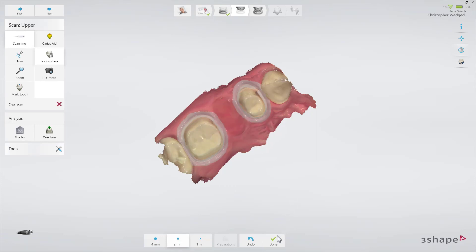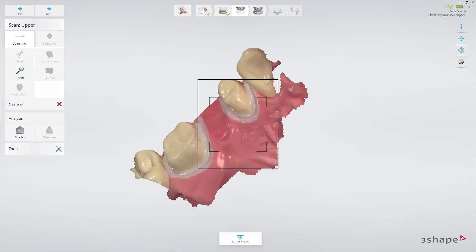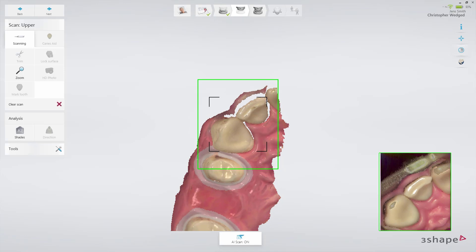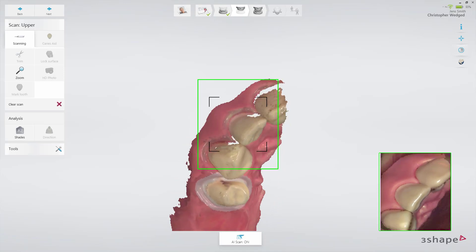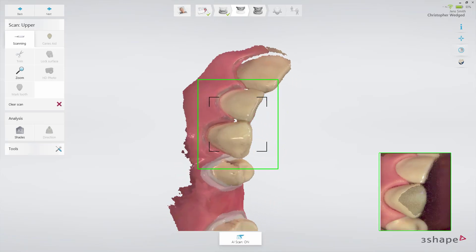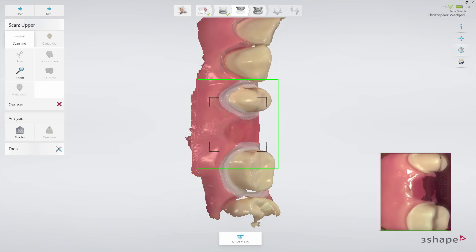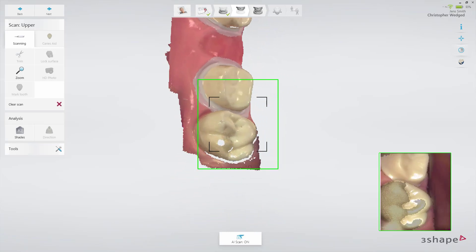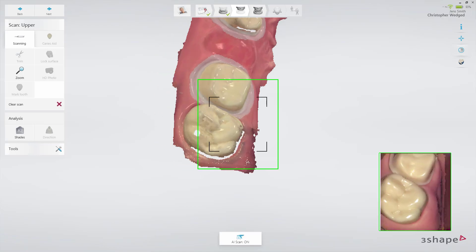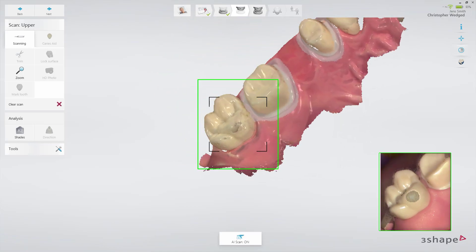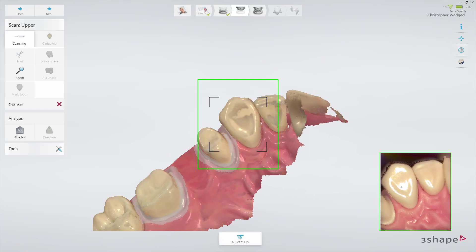Now complete the scan using the official scan strategy: continue scanning the occlusal surface from the preparation to the canine. Then, as it is the upper arch, slowly roll to the buccal side and move the scanner in the distal direction. Finally, slowly roll over the last molar and scan the lingual side.